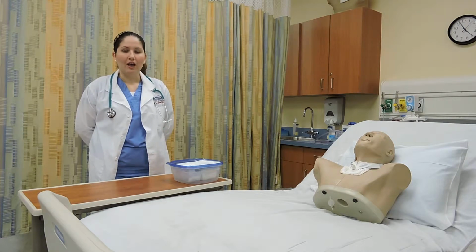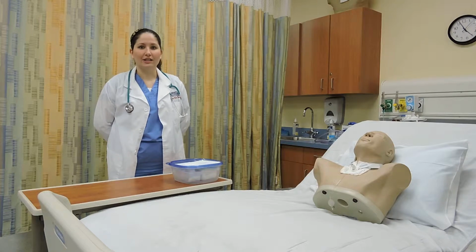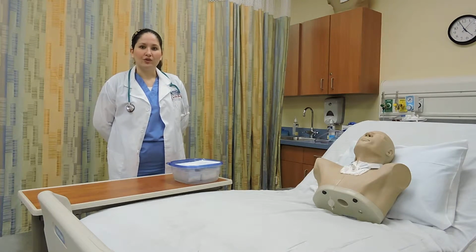There are no contraindications for trach care, but there are possible hazards and complications such as atelectasis, bleeding, tachycardia, hypoxemia, and respiratory distress.